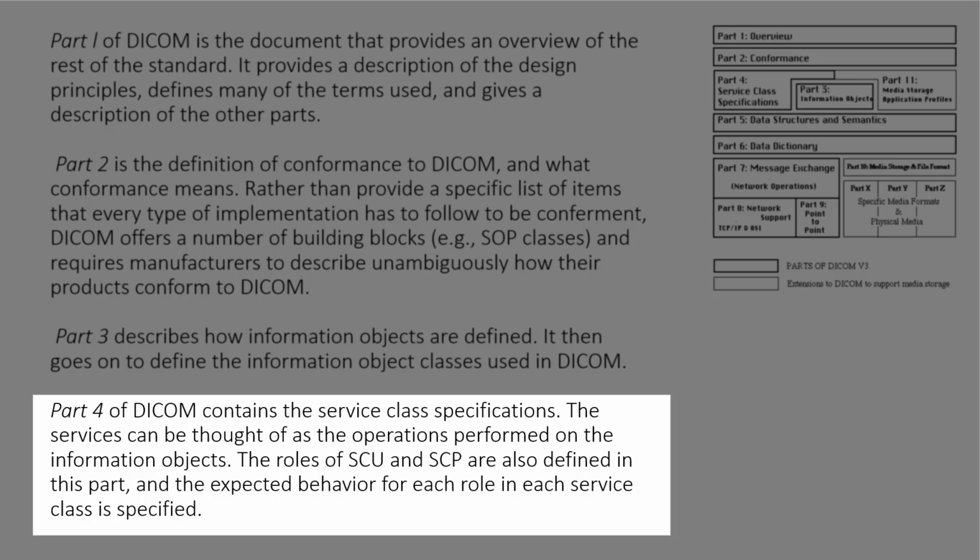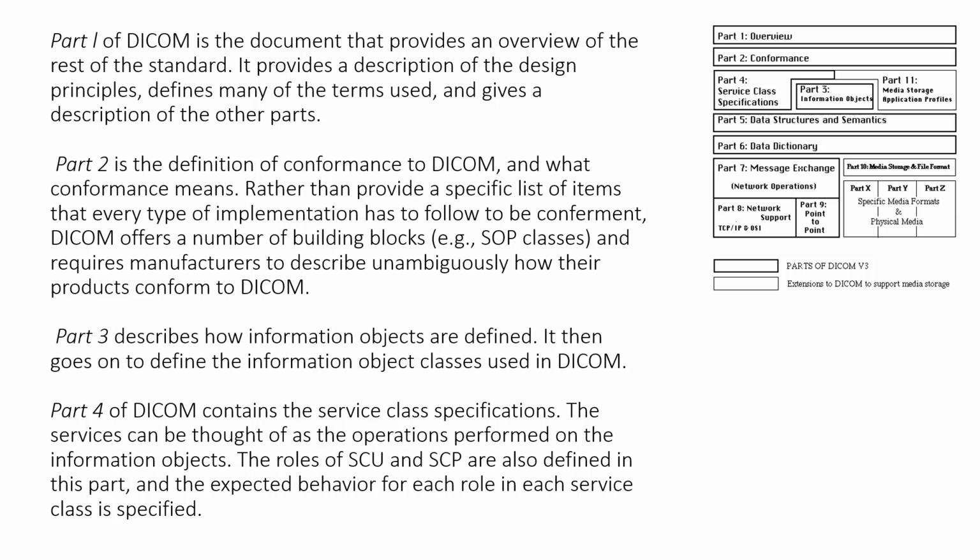Part 4 of DICOM contains the service class specifications. The services can be thought of as the operations performed on the information objects. The roles of the SCU, Service Class User, and SCP, Service Class Provider, are also defined in this part.